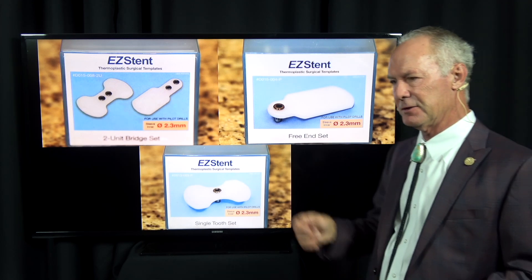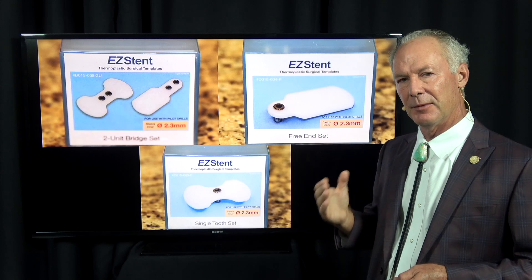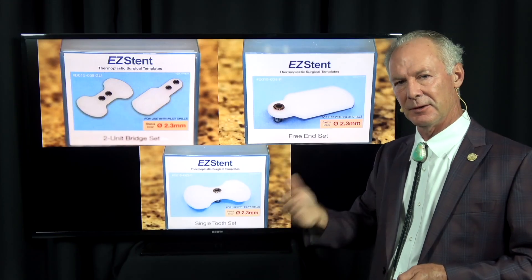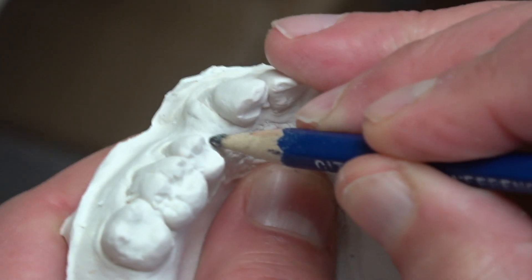If you try to freehand it, it's not that you can't do it, but it's harder than you think to get the angulation exactly right. I prefer to have a surgical guide because it orients you correctly to alignment — especially in the posterior part of the mouth where lips and tongue interfere with your ability to see the orientation of adjacent teeth and perfectly align the pilot drill.